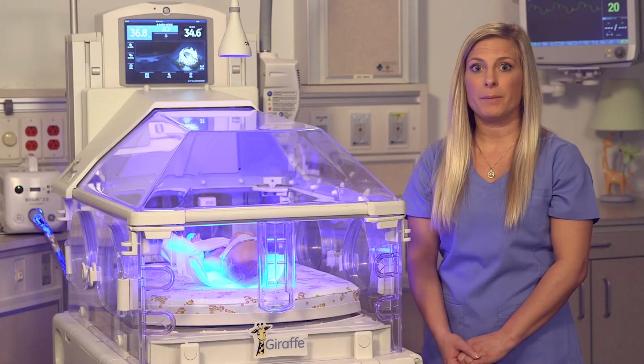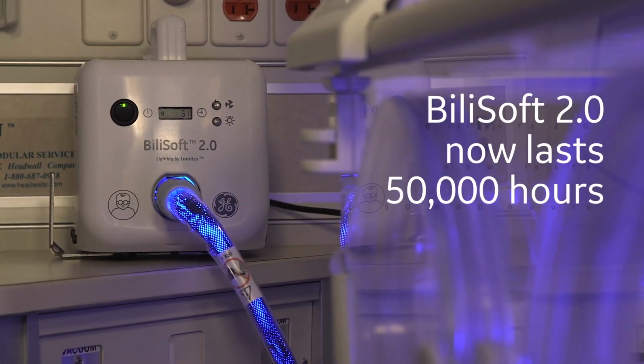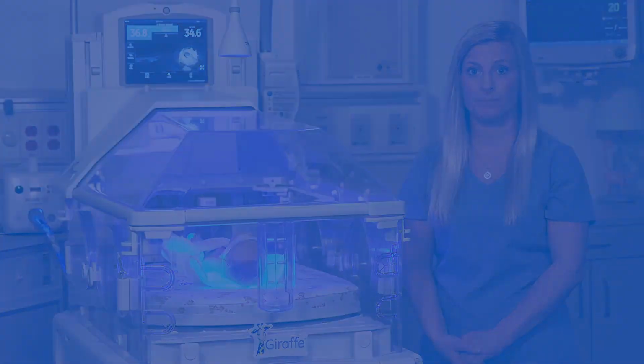Now remember, the BiliSoft 2.0 unit should work fine for over 50,000 hours of use. This is an improvement over the old BiliSoft phototherapy system, which would need replacement after 8,000 to 10,000 hours.